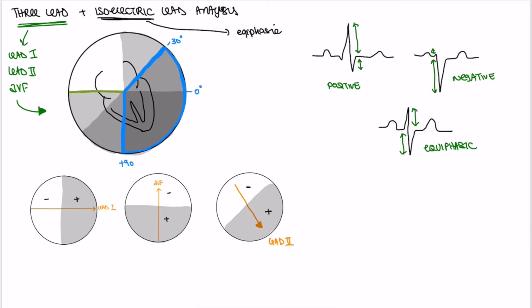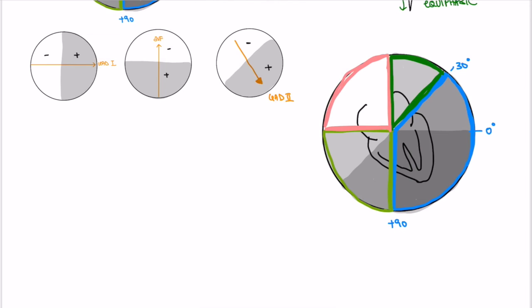The right axis deviation is from 90 degrees to 180 degrees, and the left axis deviation is the remaining quadrant of the upper right. The extreme axis deviation is still the same quadrant from the previous circle. So this is just a matter of range, and when QRS deviations are questionable, clinical symptoms will be more helpful in making a definitive diagnosis.